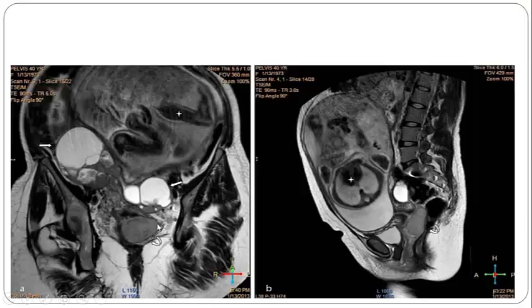We have another case. This is a full-term baby at 38 weeks, and the patient is just coming with vaginal bleeding. And here, a large problem. There were bilateral adnexal complex, solid and cystic multilocular masses, and there is also a mass seen in the vagina. This is the cervix, and here there is a lobulated mass seen in the upper vaginal part, and we follow up the case.